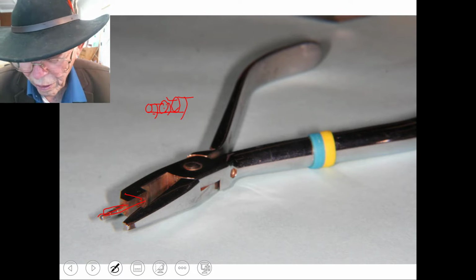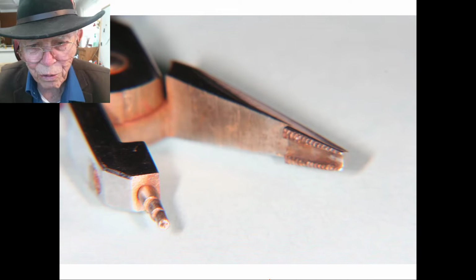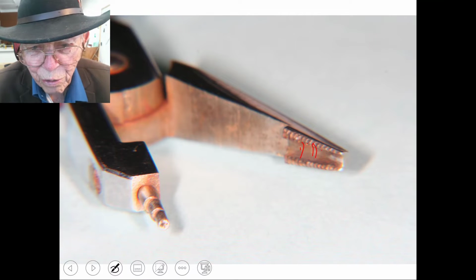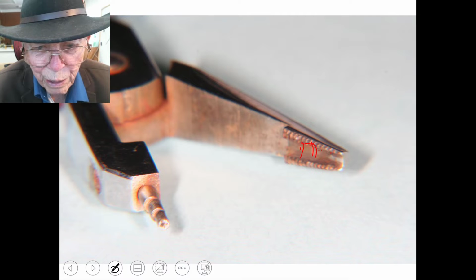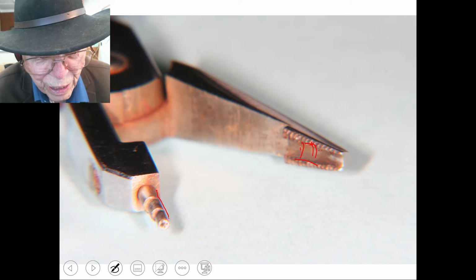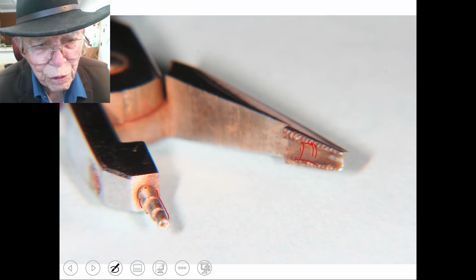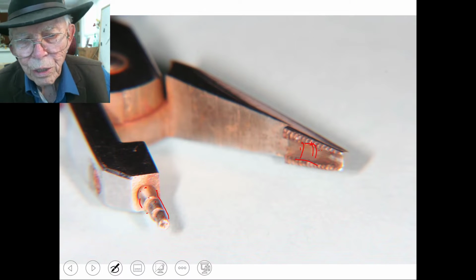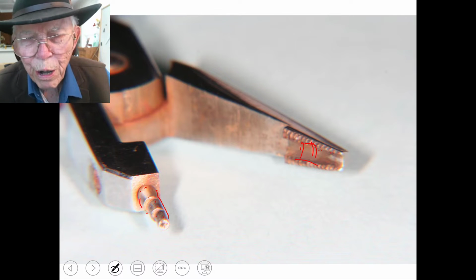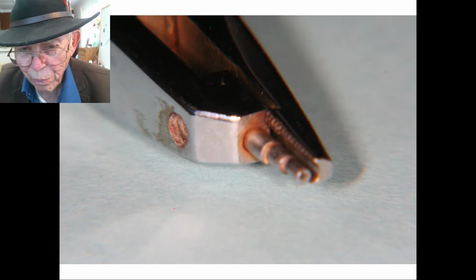So I'm going to erase that, and we'll go to the next plier, and you have a groove in here where your wire fits over that, and wherever you start, it kind of holds it, keeps it from sliding forward or backwards as you bend this. You see this side is level, and you see the 3 different sizes of loops that you can make there that you use frequently in orthodontics. And this just makes a spring. I'll show you how it works here in just a little bit.